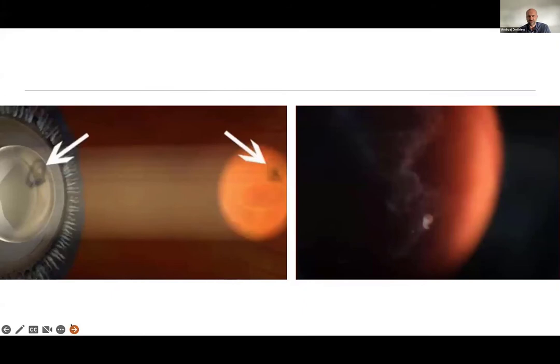Obviously, when it comes to understanding different floaters and shadows which appear on the retina, fundus photography in a specific approach, I mean focused on imaging a specific depth of focus for floaters, is the crucial aspect, and sometimes in many eyes it's not possible.